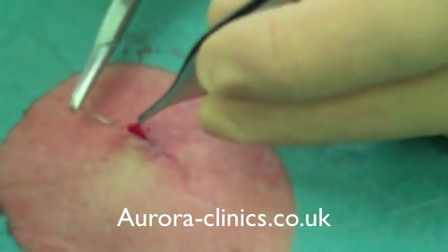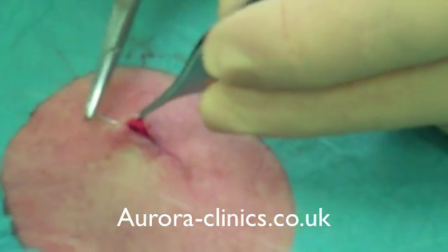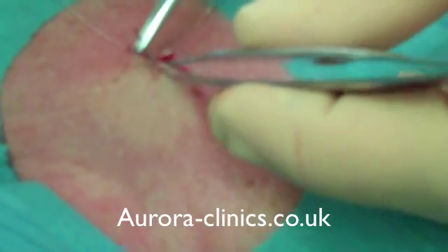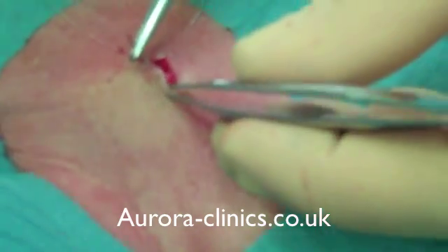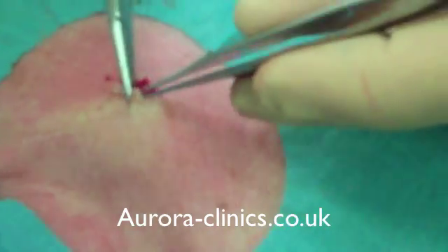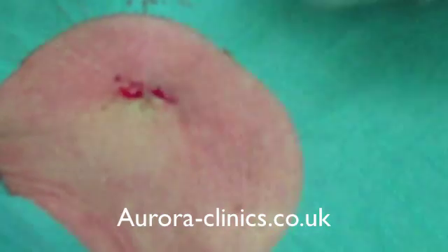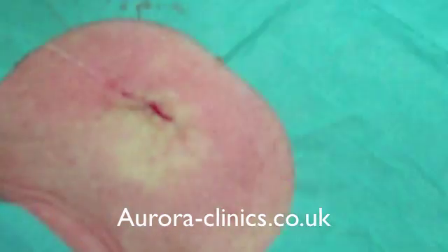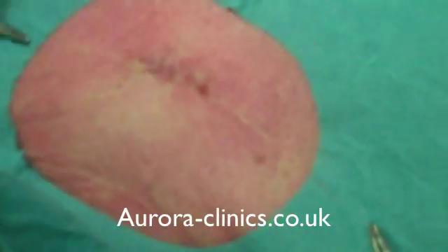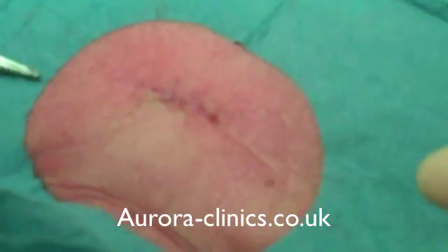The final layer of closure is a subcuticular PDS — this is probably a 5-0 — and I just run that along. This again has got no tension on it; that's the important point: no tension on the skin.